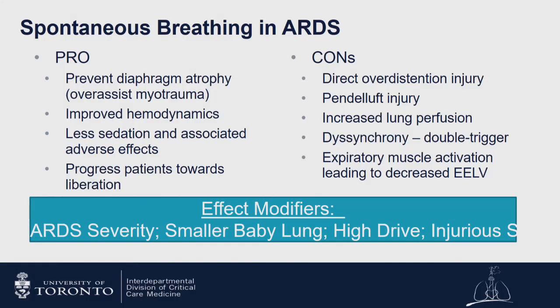So here are the pros and cons of allowing spontaneous breathing in ARDS. On the pro side, we could prevent or minimize diaphragm atrophy, this so-called overassist myotrauma. We might improve hemodynamics because we're generating some negative pressure in the chest, and that can both increase venous return and mean that we don't have to use as much positive pressure, which may make the right heart happier. The patients are breathing spontaneously, so maybe you'll be able to get away with less sedation and its associated adverse effects. And you're progressing the patient towards liberation and getting them off the ventilator by having them doing some of the work of breathing.